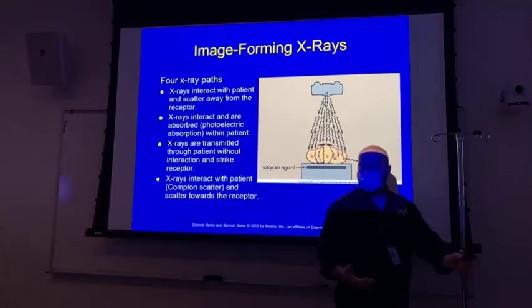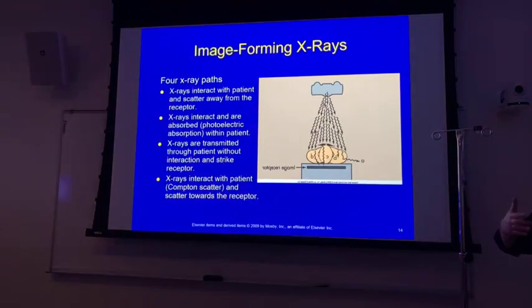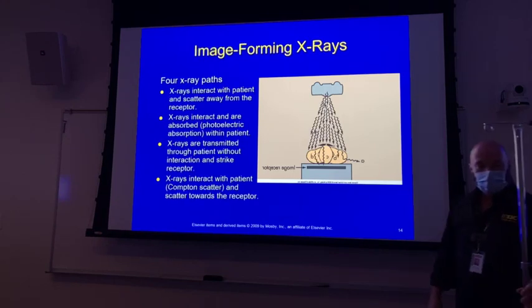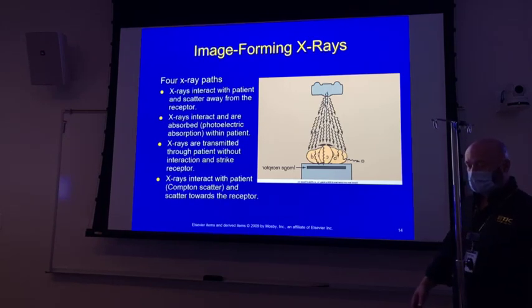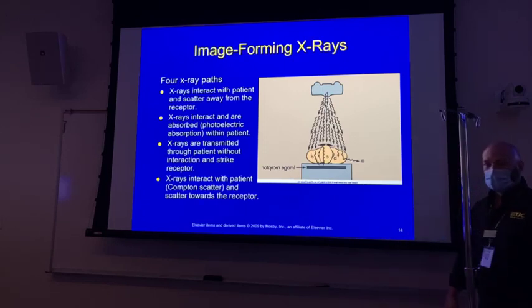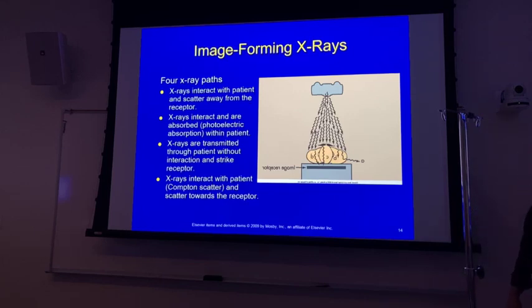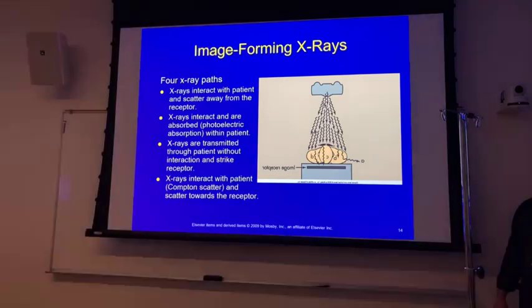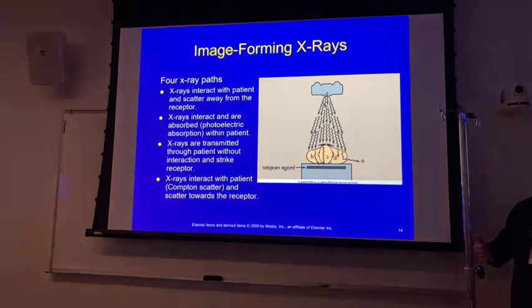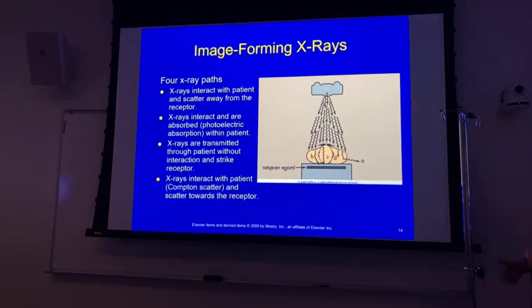also, in that same room, had a wall bucky, on the exit door. So the door, the wall bucky is here, right? Wall bucky is here. And there was a guy, we're shooting chest x-ray on this patient. I shot the PA, and he's standing outside the room, so he's got that radiation protection here, right, in the wall. He's also about 6 feet away, a little steeper than 90 degrees, but he should be okay because you got all that barrier, right? So he's standing outside the room. I shoot the PA, hand him the film. I shoot the lateral, and he goes into the dark room and develops both of them.